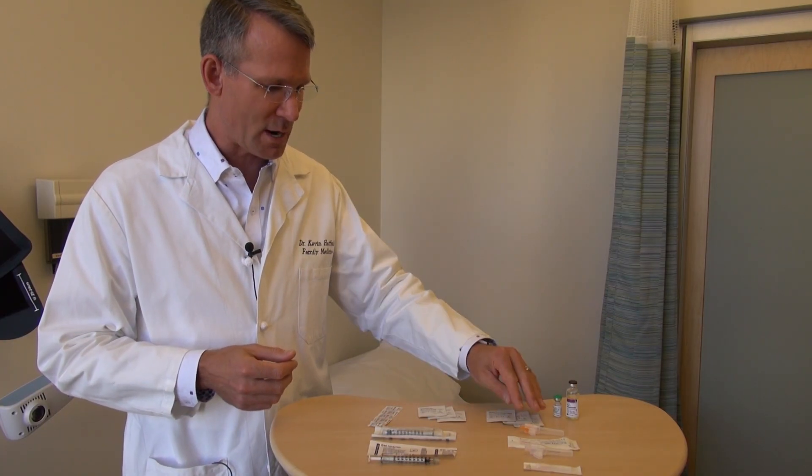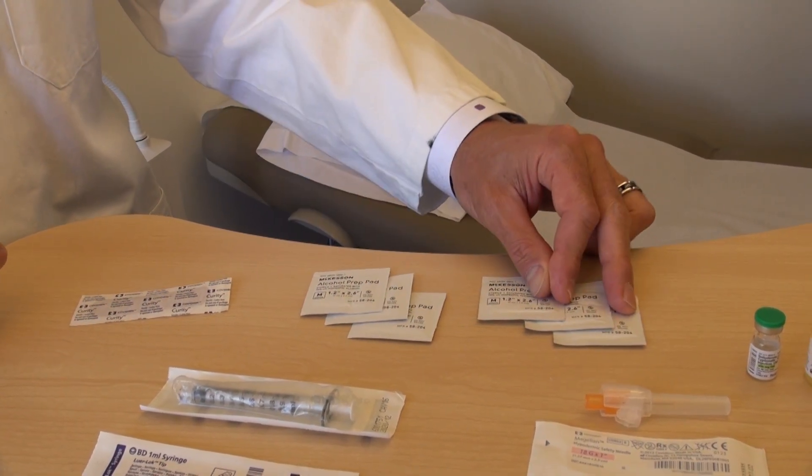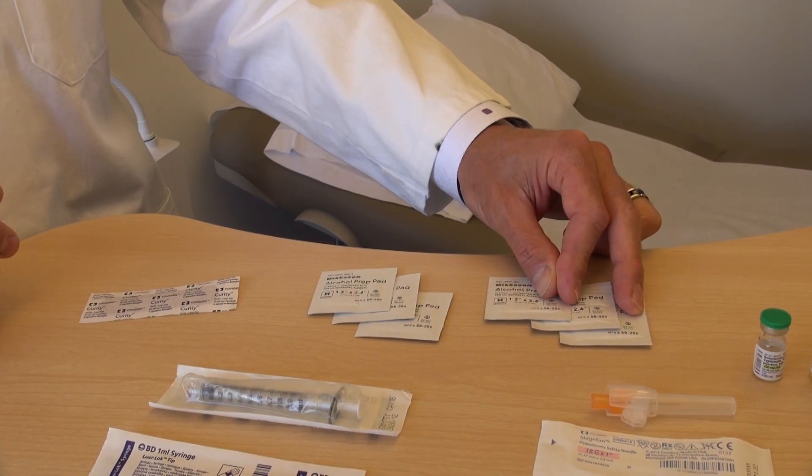The other thing you'll need is alcohol swabs — we've got six here on the table. Three are going to be for wiping the top of the bottle, and three are going to be for wiping your skin before you do the injection.